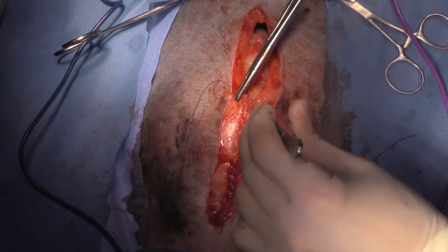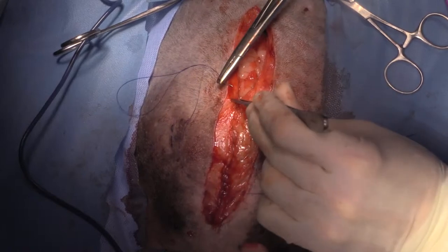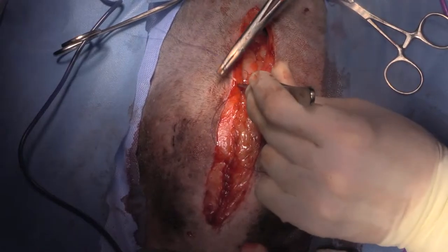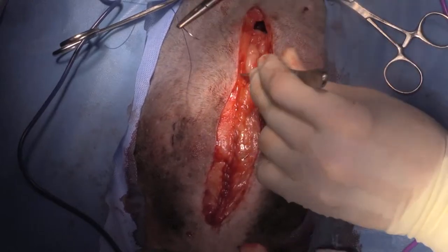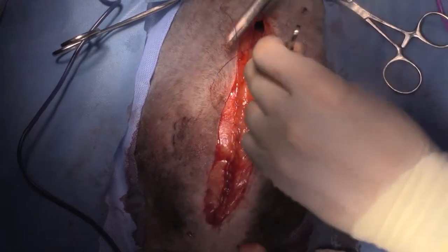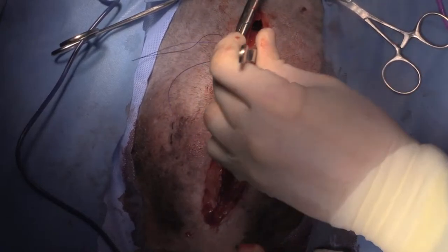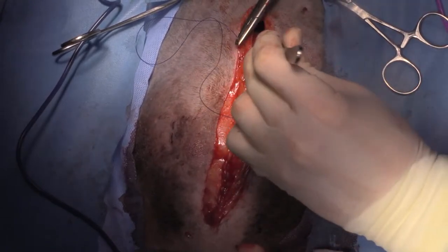So you may have noticed that I've chosen not to flush this dog's abdomen with any sterile saline because we did not have any leakage from the gallbladder. We did not end up having to do an enterotomy. I'm not overly concerned about flushing this dog's abdomen. And we did have everything packed off at the time. So again, there hasn't been much in the way of any blood clots that may have formed and sat in the rest of the abdomen and go on to form adhesions. So we have not flushed this dog's abdomen and we'll not be placing a drain either, as again, we're not concerned at this stage about either any ongoing bleeding or dehiscence of any surgical sites such as an enterotomy or a breakdown of the ligature around the cystic duct.